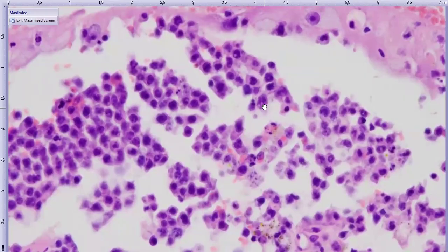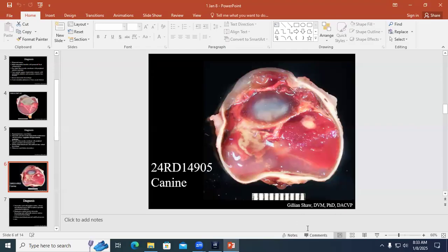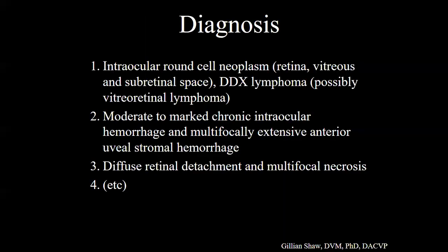Any questions about that? Let's see here. Okay, so refine our immunomarkers. Yeah, Dr. Gasper, who's here in the audience, definitely helped me look at the IHC. And it was difficult to make up our minds about that one. So there we go. There were a whole bunch of diagnoses in this case, but I decided to distill it down to these. So, yeah.